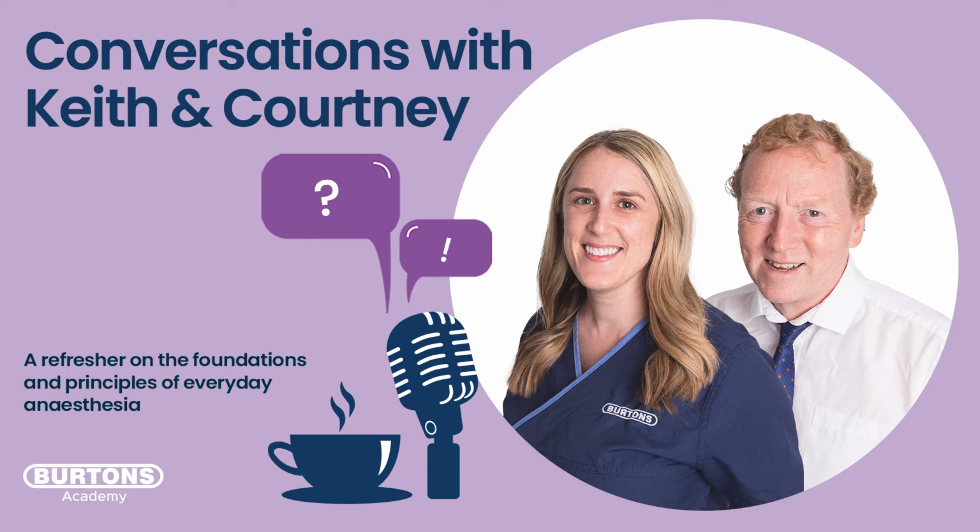Yeah, there is. And to mention one other thing, you have to, to some extent, take into account the way that the CO2 is being measured. So you've got two processes. We've got a mainstream capnograph and a side stream capnograph. Now, a mainstream capnograph is obviously where the animal's breathing through a tube which is sensing across that tube, and it's connected right at the end of the ET tube, so there's no delay in seeing what's happening. And the side stream is where you're taking off a sample of the gas down a long tube and doing an analysis a little way away, and there's obviously a delay going on there.